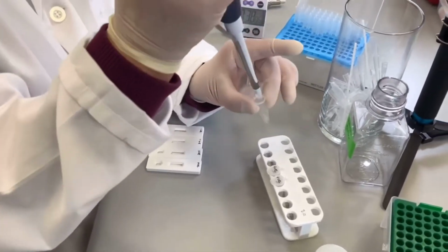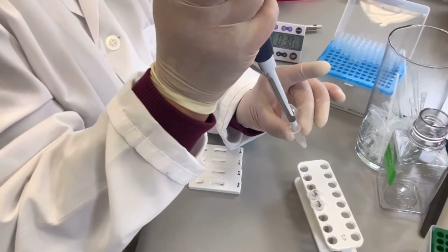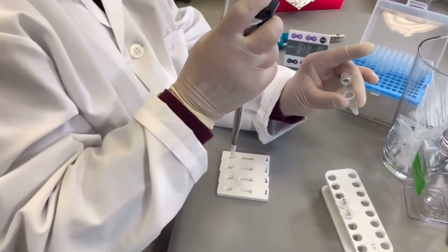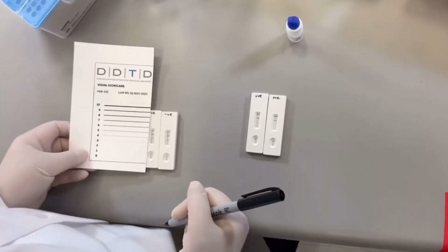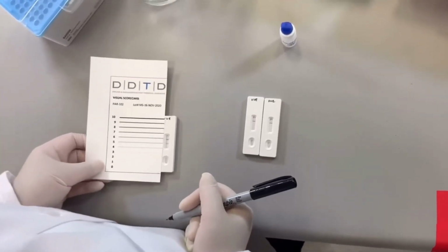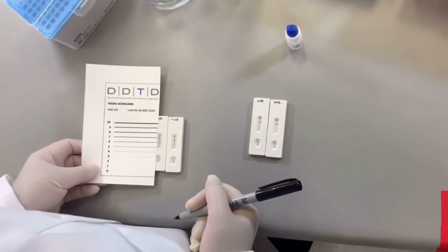Transfer the vial content to the sample port of the cassette. Start timer or record the start time. Repeat the nanoparticle collection for each sample. Read the tests after 10 minutes and again after 30 minutes from the start time. Bring the test as close as possible to the test card and score the test line intensity.